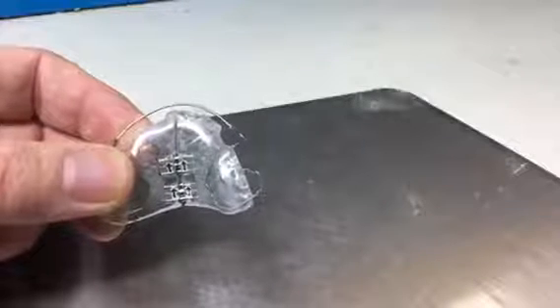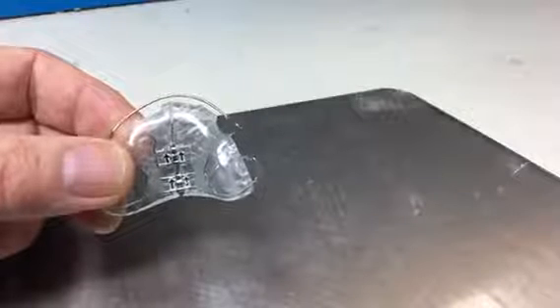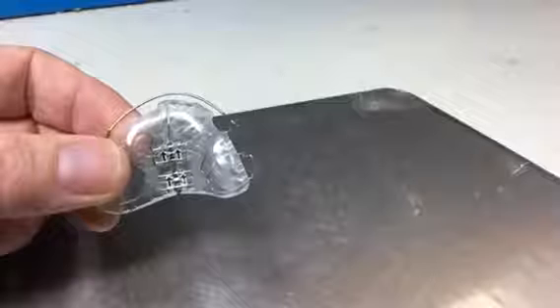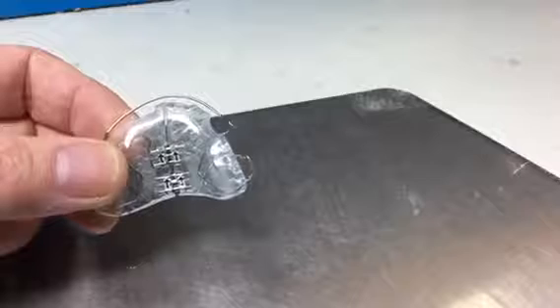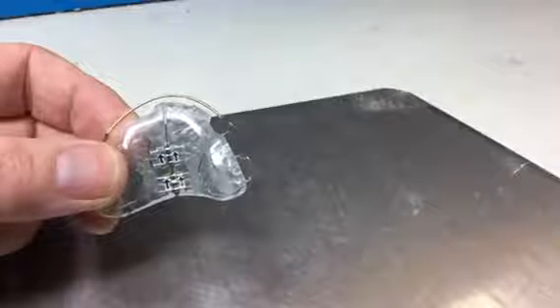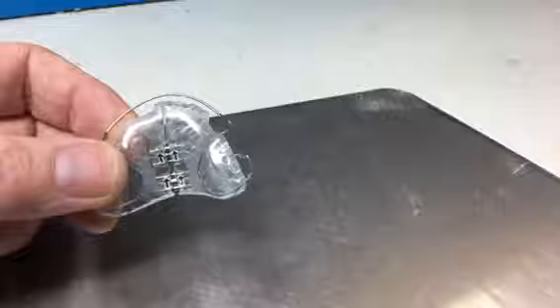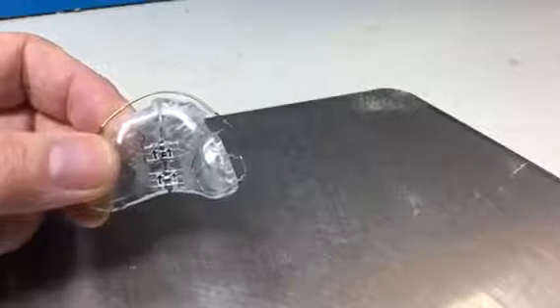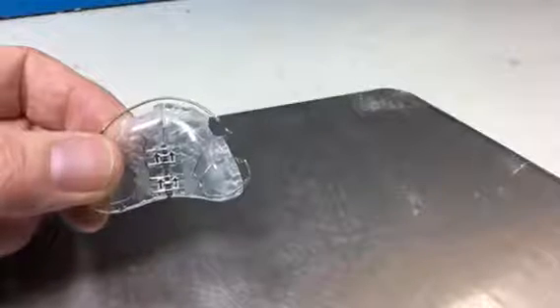With an appliance that has two screws in it such as this one, once you get those two screws open by about a millimeter, you can start opening the front screw a little bit more than the back screw, or the back screw a little bit more than the front screw, just to give yourself a little bit of versatility in where exactly you're expanding in the arch. So if the arch is quite V-shaped after opening a millimeter, you can start opening more on the front screw than the back screw.